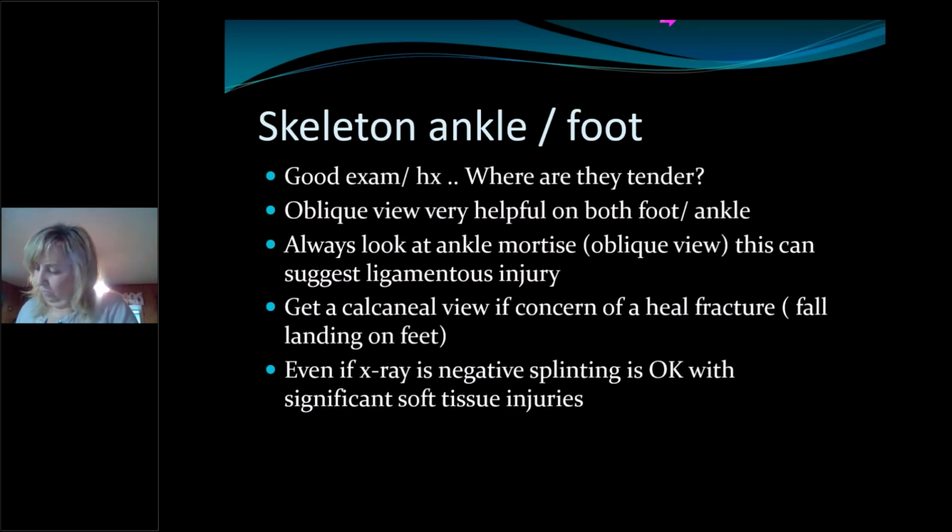Even if the x-ray is negative, if they've got significant soft tissue swelling over the lateral malleolus and it looks like a fracture, smells like a fracture, but the x-ray just doesn't show it, it's still a pretty significant soft tissue injury.